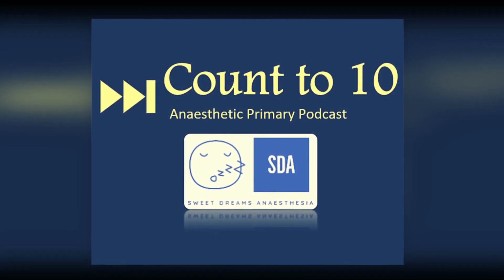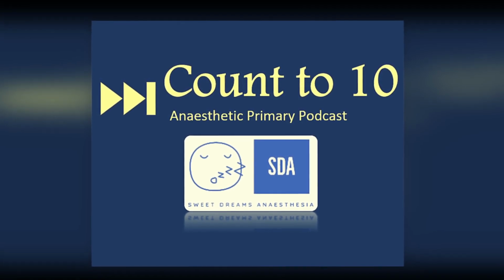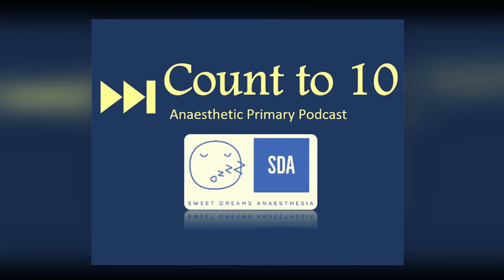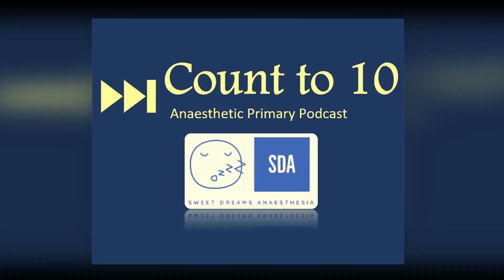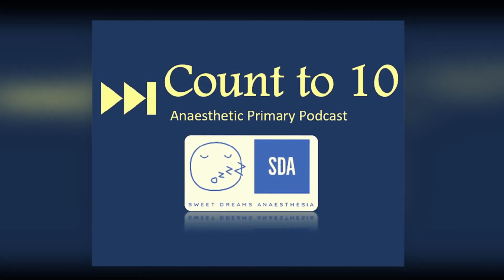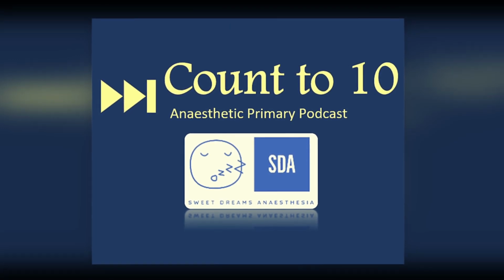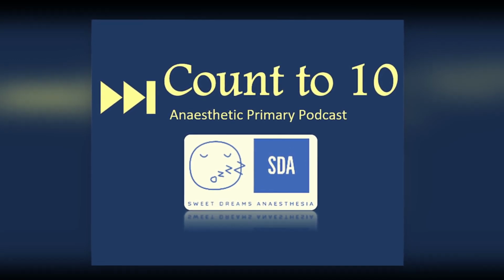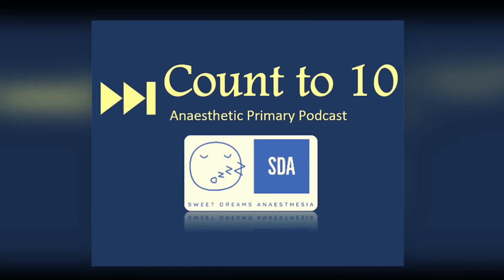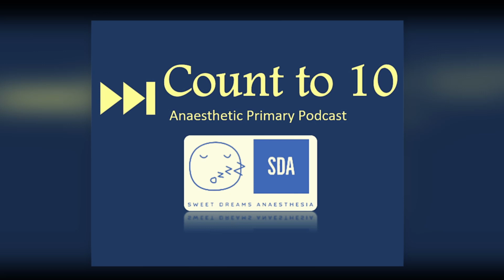Now the R values that are calculated are useless themselves, but they've been calibrated in a series of studies using healthy volunteers who were breathing in increasing hypoxic mixtures from a saturation of 100% down to 75% to come up with a predetermined curve which then correlates the R value to a saturation percentage. This is one of the major pitfalls of the pulse oximeter in that values below 75% have been extrapolated from the data itself, and the significance of this is that they're less accurate.